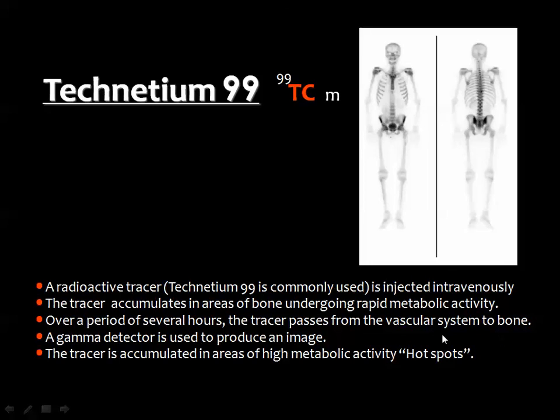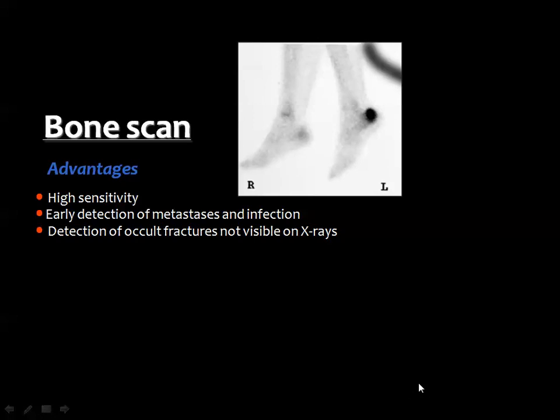Then you should consider also the radiation dose, and a bone scan is in between X-rays and the CT. The dose is more than that of the X-rays and less than that of the CT scan.